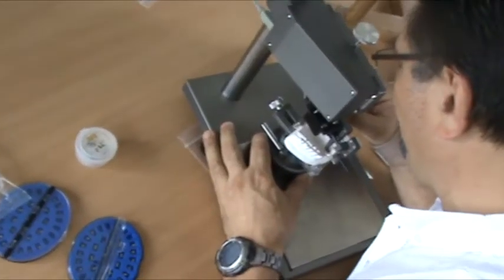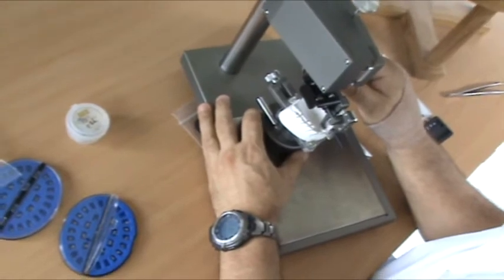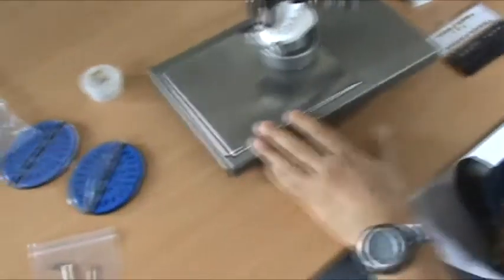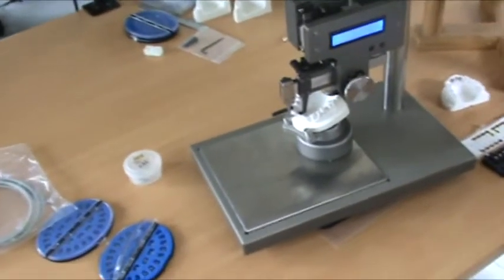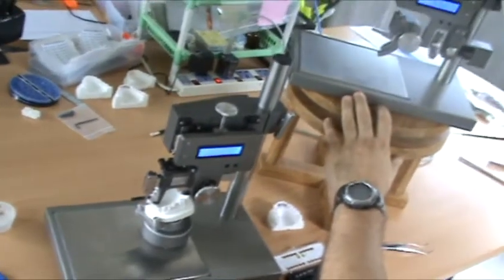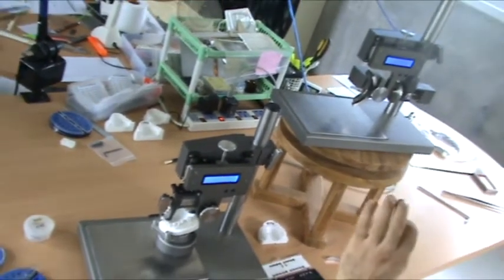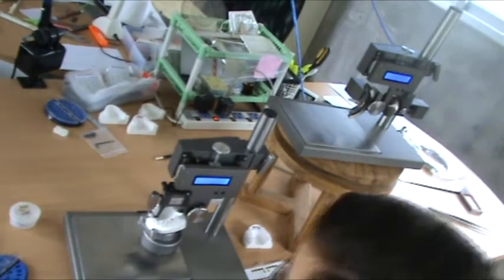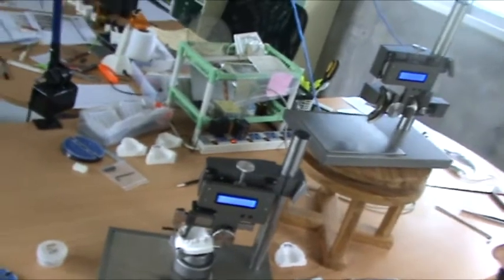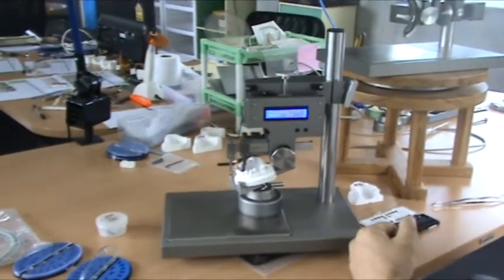And this time we have controlled the slot of the bracket. Even when we're bonding labial, we've controlled the slot of the bracket to be exactly the tip and the torque we decided. If we bond by hand, then the tip and the torque can change. We're not bothered about thickness. We bond as close to the tooth as possible with the labial.